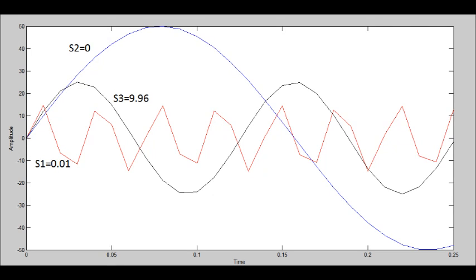An important part of our device is the ability to sense seizure through the neural electrode that's connected to the brain. Because what you want to do is be able to take in data from the electrode, determine whether a seizure is happening, and know when to start cooling. And so the algorithm that we have is able to take in the data, change it a little bit in order to determine whether there's a seizure happening or not.